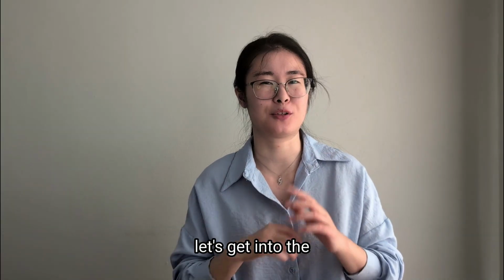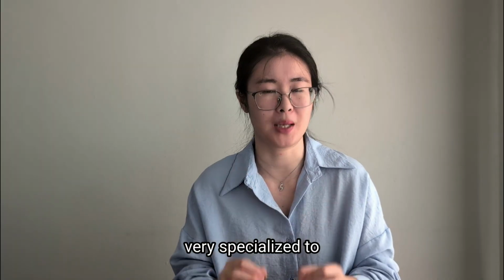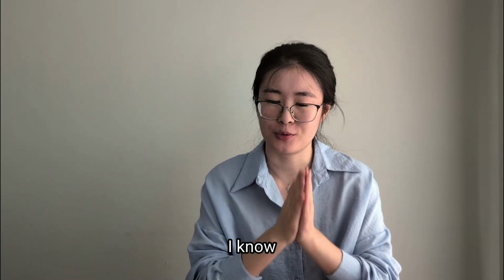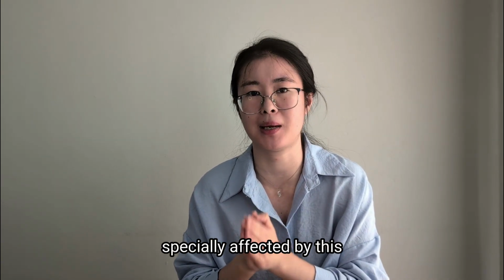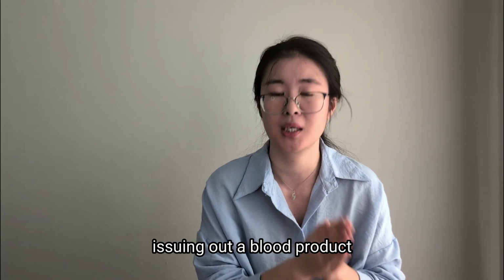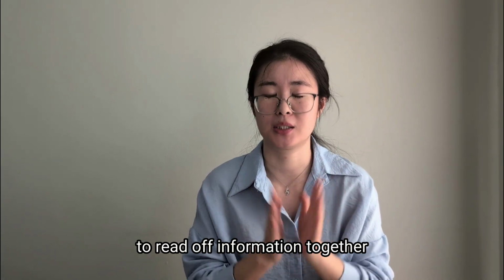And now let's get into the last part. This part is also very specialized to the blood bank. That is being understaffed. Well, I know you may say, isn't that happening to all departments? Yes, but the blood bank is specially affected by this because to issue out a blood product, it needs 2 people to read off information together.